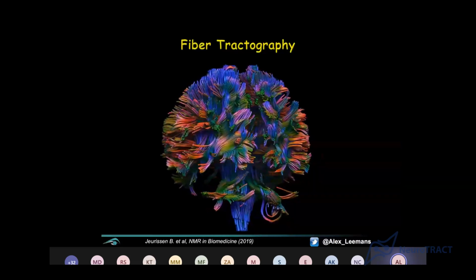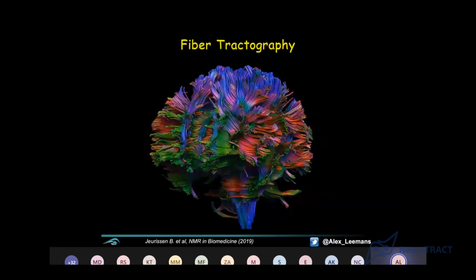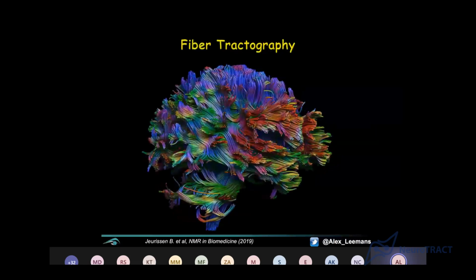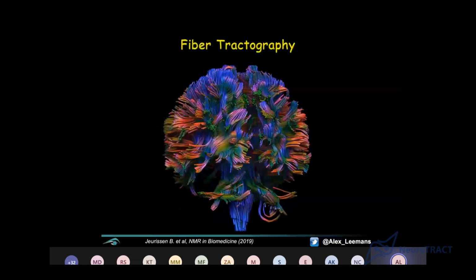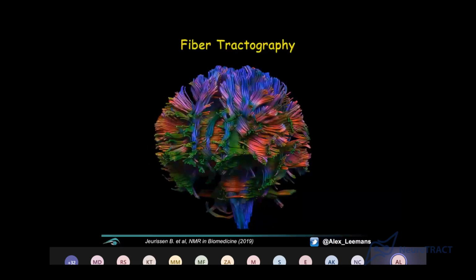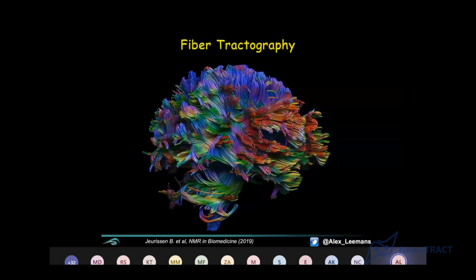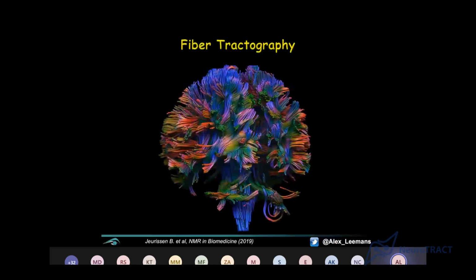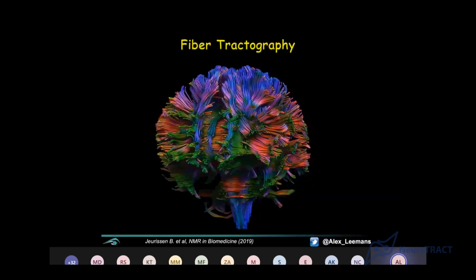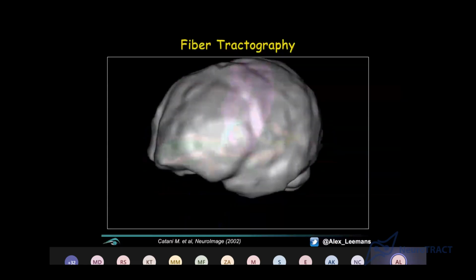And keep in mind, these are not direct representations of pathways, right? I once had one junior neuroradiologist, and he came up to me and he said, "Oh, Alex, I didn't know axons were that thick." Okay, so obviously the thickness of these little tubes that I'm showing you is not reflecting in any way thickness of pathways. It's just a way to convey the architectural configuration with shadings, and you get an idea of how these pathways are represented in the brain. Okay, it's just a visual representation.